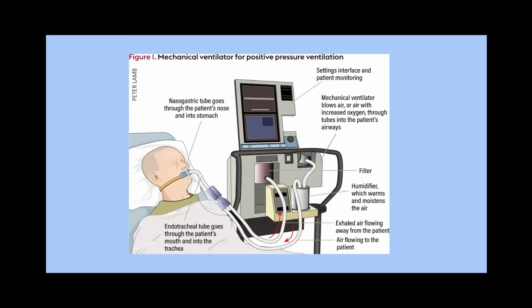That being said, whenever you have a disconnection from the ventilator, everyone always fixates on the endotracheal tube, but take into account that the ventilator has multiple parts, and the ventilator circuit can have multiple disconnections all the way from the direct endotracheal tube that goes to the main circuit, the inhalatory port, the exhalatory port, the humidifier, the filters, all of that can have these connections everywhere along the route. So whenever you're seeing that, don't fixate, oh, the ventilator is connected to the endotracheal tube, everything's okay. You got to check the entire ventilator circuit to make sure that there's no leak as well.